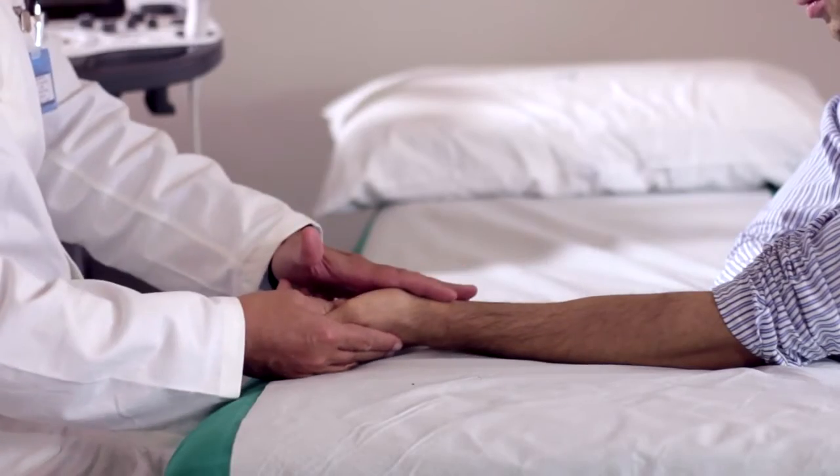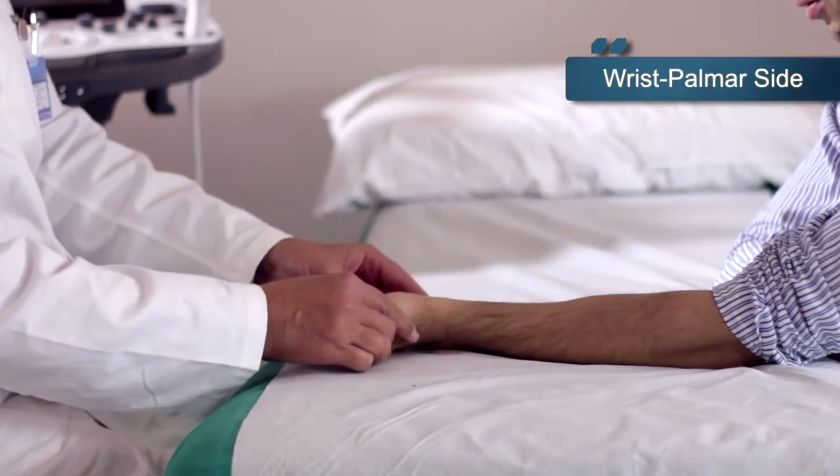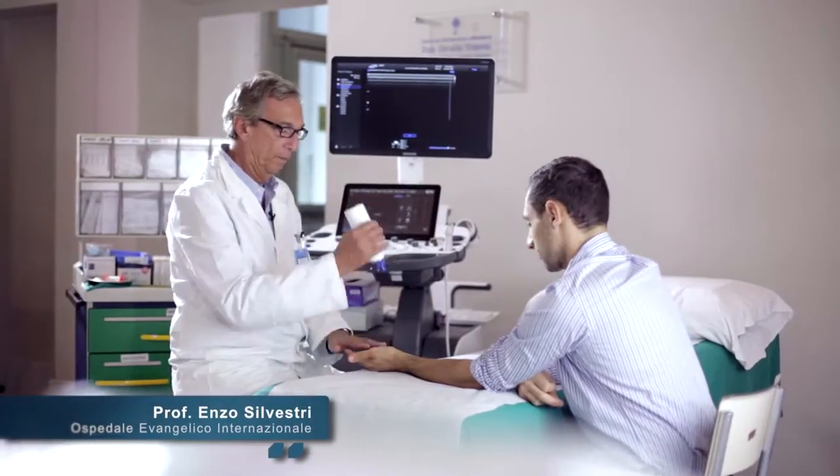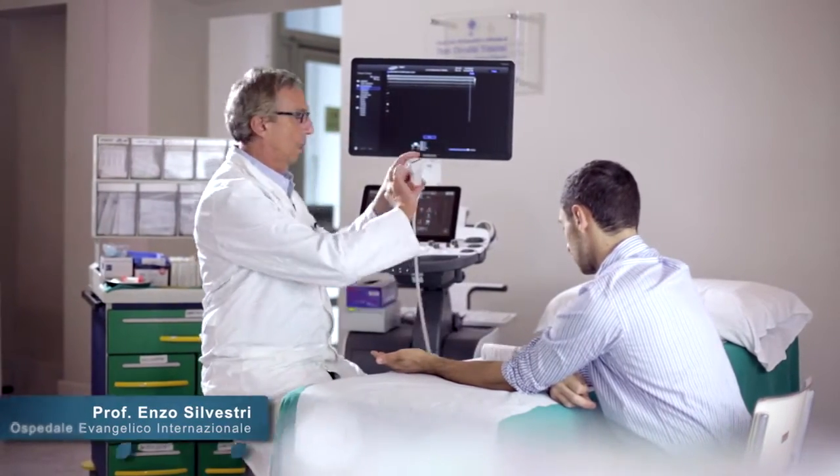For the ultrasound scan of the wrist, we shall split it into two compartments, the palmar compartment and the dorsal compartment. We will evaluate the structures with the scanning planes targeted to the palmar compartment of the wrist. The most important thing to analyze is the median nerve.